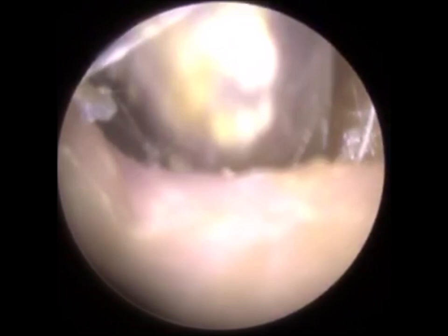The other issue with keratosis obturans: this client's already got an enlarged ear canal due to their mastoidectomy. However, dead keratin itself can cause erosion of the bony part of the canal wall, so it's quite possible that this skin, because it's been in there for a long time, has actually widened his ear canal even more. As you can see, I'm working at the back of the ear canal here. This is the mastoid region, and I'm trying, as much as I can, to loosen this adhered spongy skin off the canal wall, but it is a very, very difficult case.